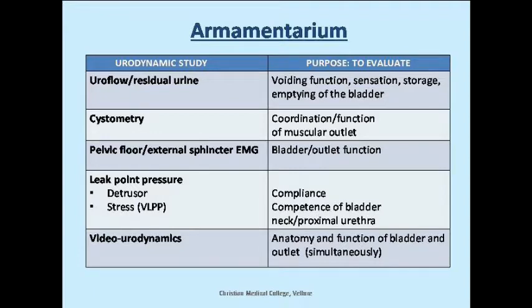And the main reason is, as alluded to by the previous speaker, we want to know: is this child's bladder safe? Can it store urine at a low pressure? It's very commonly seen that people are very fascinated by high voiding pressure, but one must remember that you void probably 4 or 5 times a day; an infant may void more often, but the maximum time spent by the bladder is during filling. So it's the filling pressures which are far more important to upper tract damage than an isolated high voiding pressure which occurs much less frequently. So one of the very important parts of urodynamic evaluation, especially in neurogenic bladders and posterior valve, is the filling pressures.